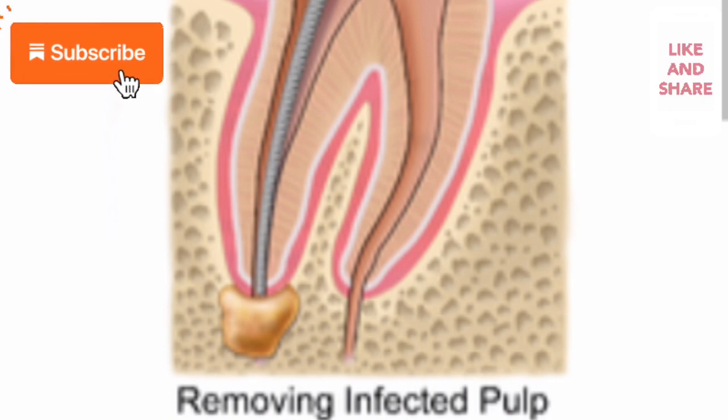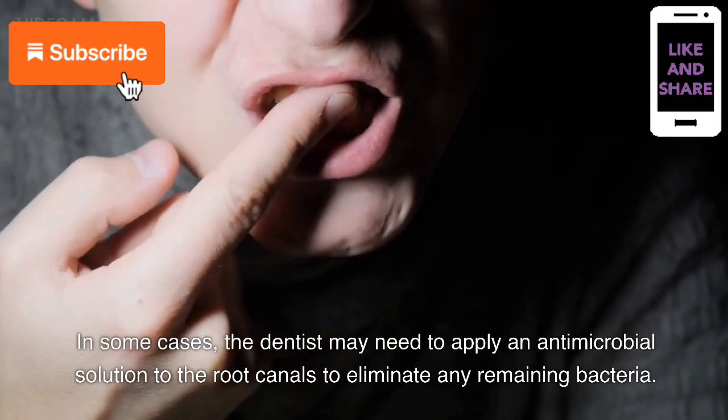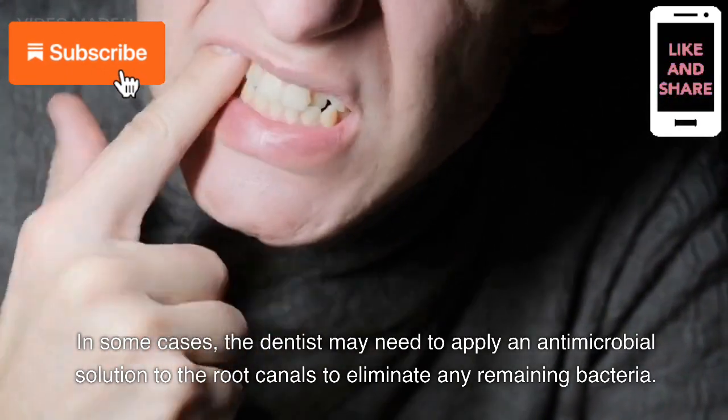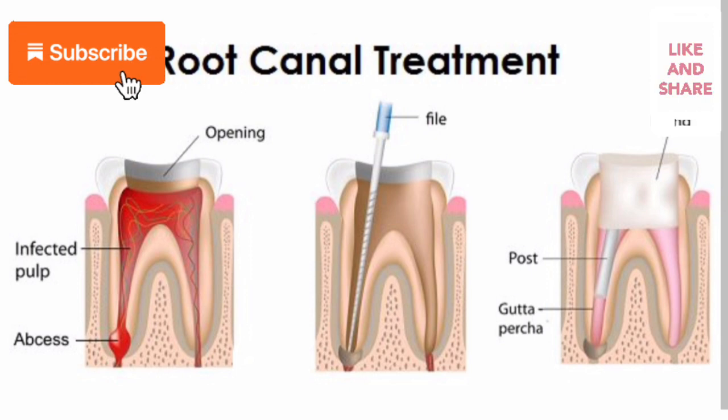In some cases, the dentist may need to apply an antimicrobial solution to the root canals to eliminate any remaining bacteria. Once the root canals have been cleaned and shaped, the dentist will fill them with a rubber-like material called gutta percha. The opening in the top of the tooth will then be sealed with a temporary filling.